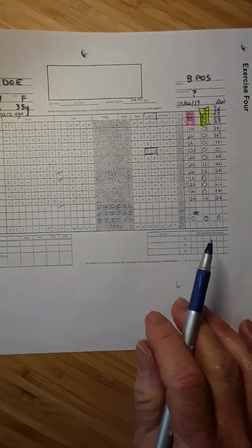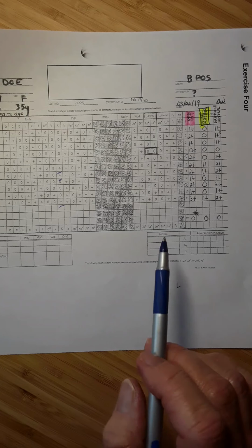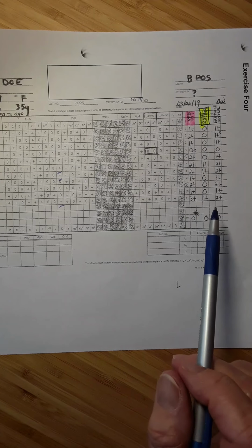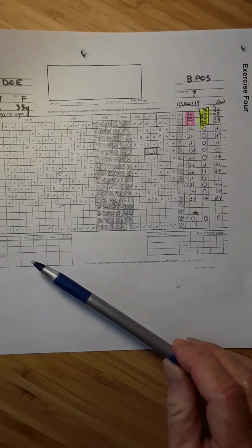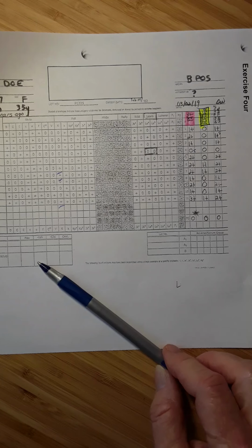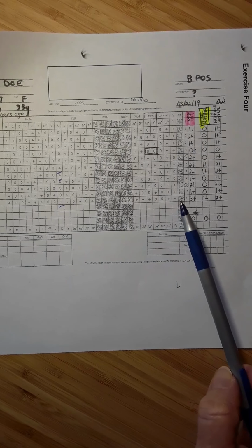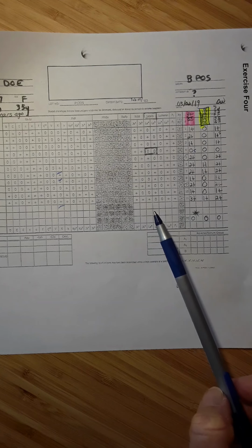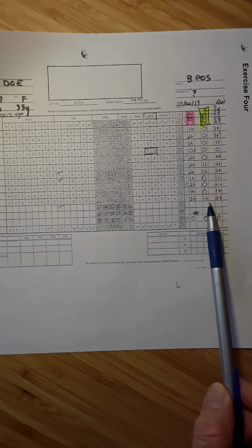We would still have a little bit of work to do on this panel to make sure that there's nothing else present, and do what we call ruling out and a variety of other little tests, but we'll leave it at that for now because we haven't covered antibody ID. If you have questions about this, please post on the discussion board or send me an email. The sticking points, like I said, is kind of the decision to originally neutralize the Lewis, just on a hunch, and then the other sticking point for students is trying to figure out where I'm coming from. Why do I think there's an anti-K there?